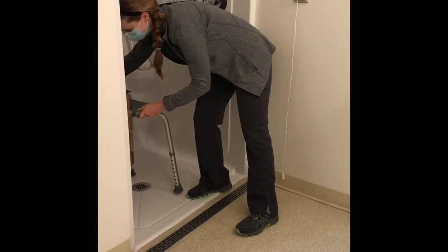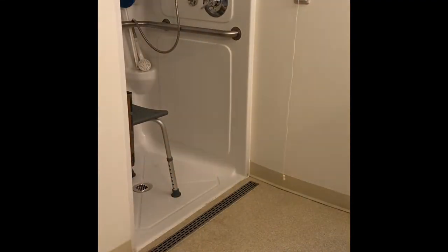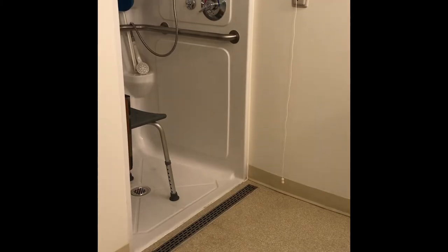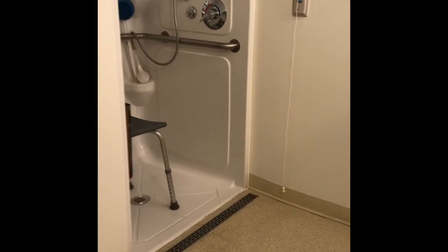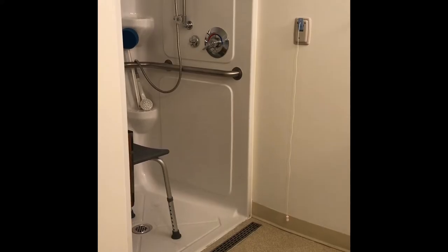Grab bars are also recommended for your safety while getting in and out of the shower. Do not hold on to a towel bar or soap dish for support — you are at risk for falling. Have your caregiver help you get in and out of the shower.